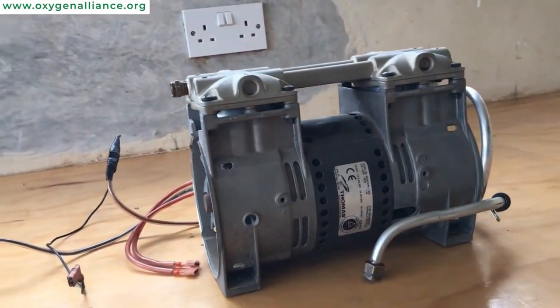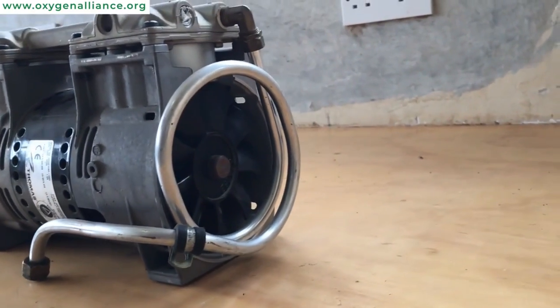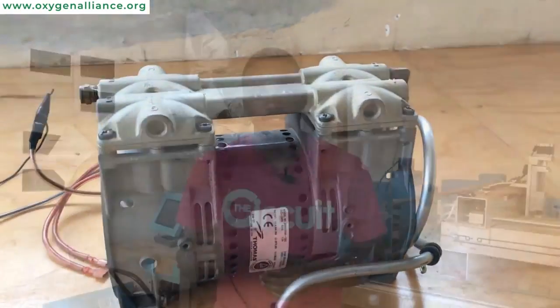There are multiple models of compressors and the process of servicing them is pretty much the same. Just make sure that you have the right tools for the screws on that particular model.